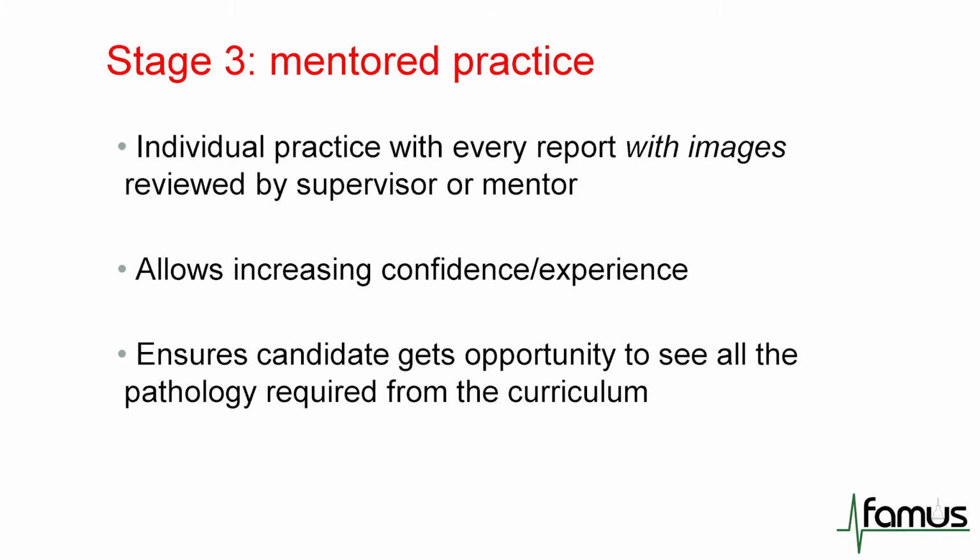So you still report every single scan with images, and they do need to be reviewed in due course by your supervisor or mentor, but you can do these scans on your own. And this will allow you a chance to get increasing confidence and experience. And as I said, it will allow you to get a chance to see all of the different pathologies that you need to image.